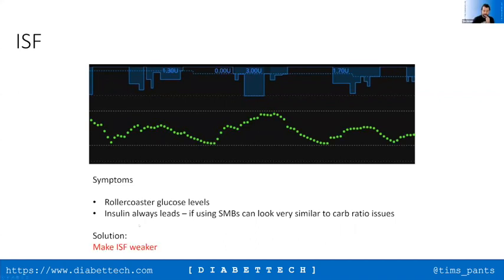And I would say that's exactly what you want to do, and I've deliberately used a term there to make it confusing. Yes, I would agree with you. I think in this case, we know that the ISF number was set to too small a number and needs to be increased.